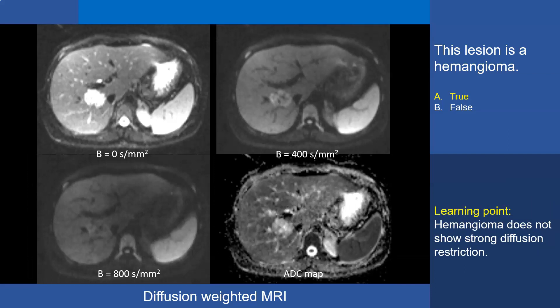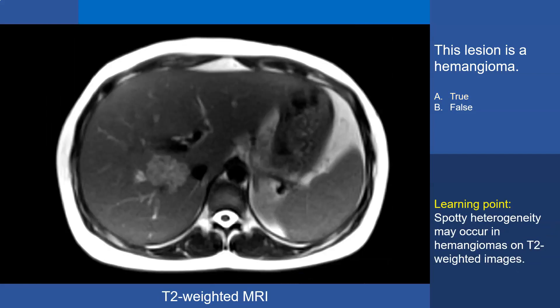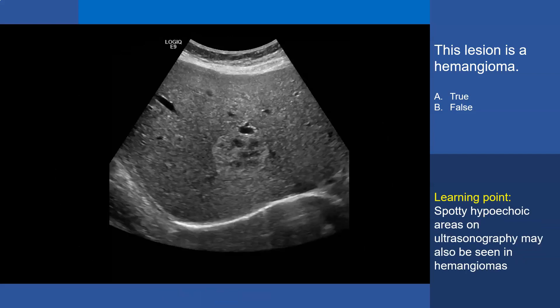This is the appearance of the lesion on diffusion-weighted images. As expected in hemangiomas, diffusion restriction is less than that of the liver — hemangioma does not show strong diffusion restriction. On T2-weighted images, there are spots of hypointensity within the lesion, which may represent small spots of thrombosis. On ultrasonography, these spots of thrombosis appear hypoechoic within the typically hyperechoic hemangioma.